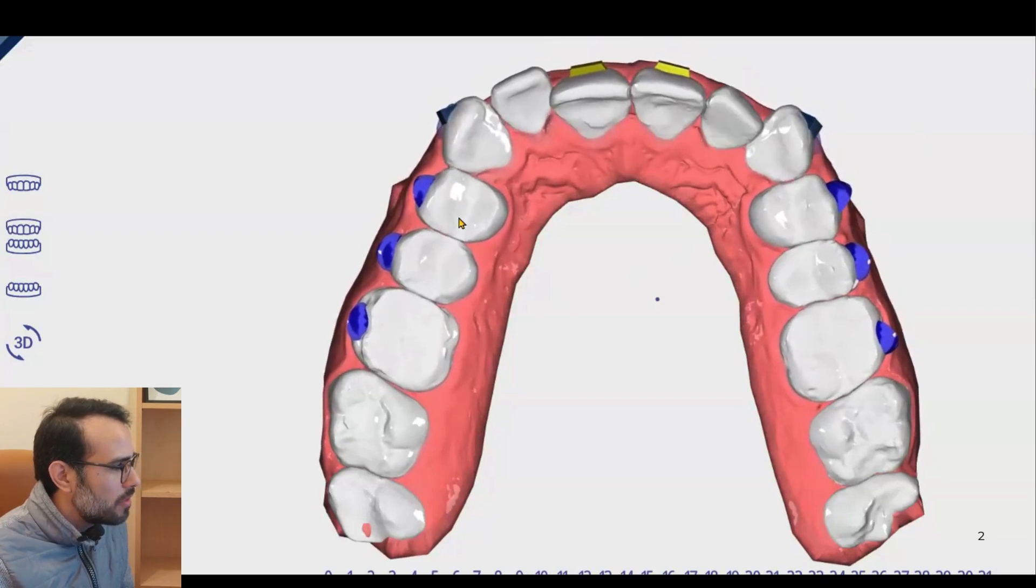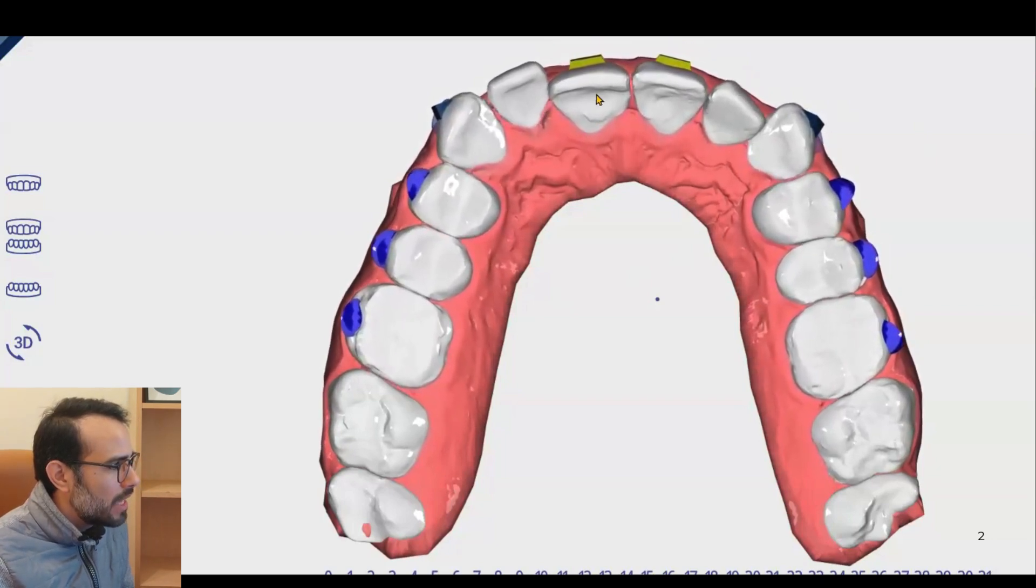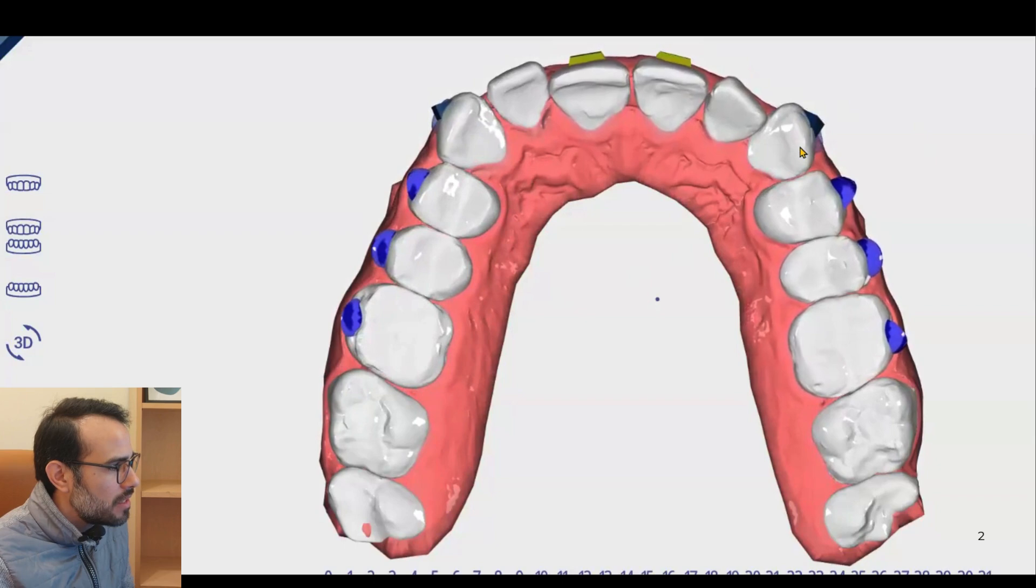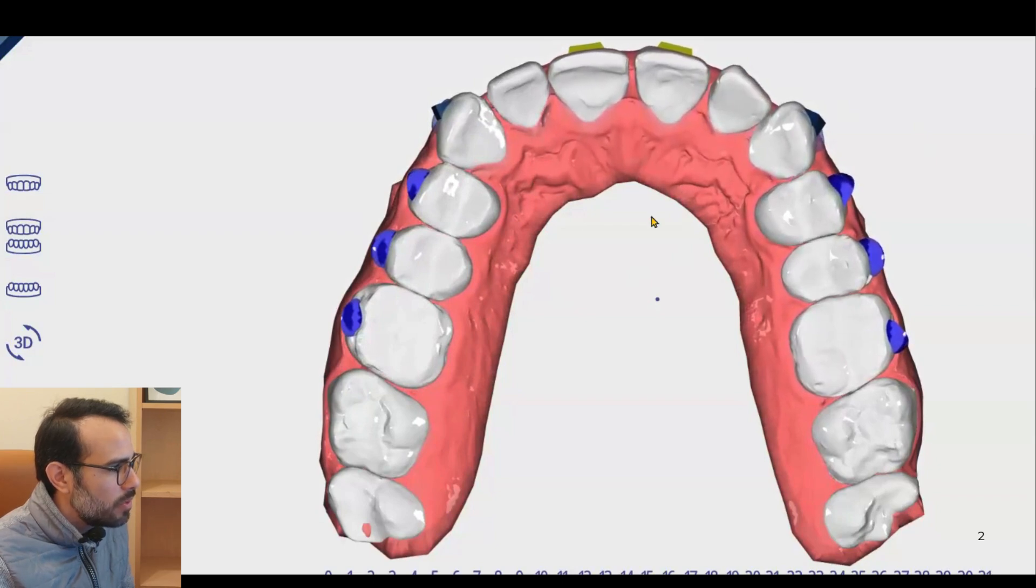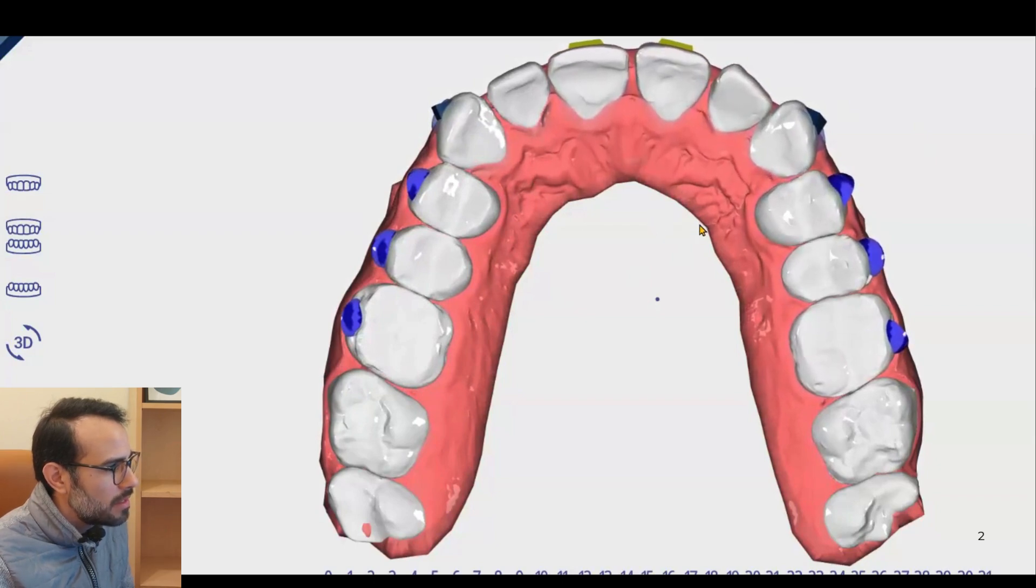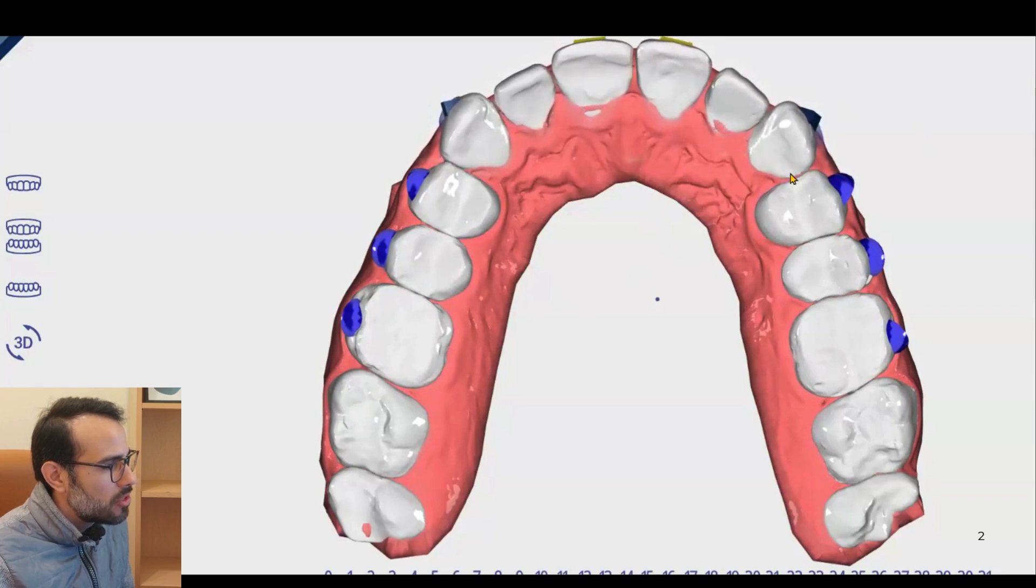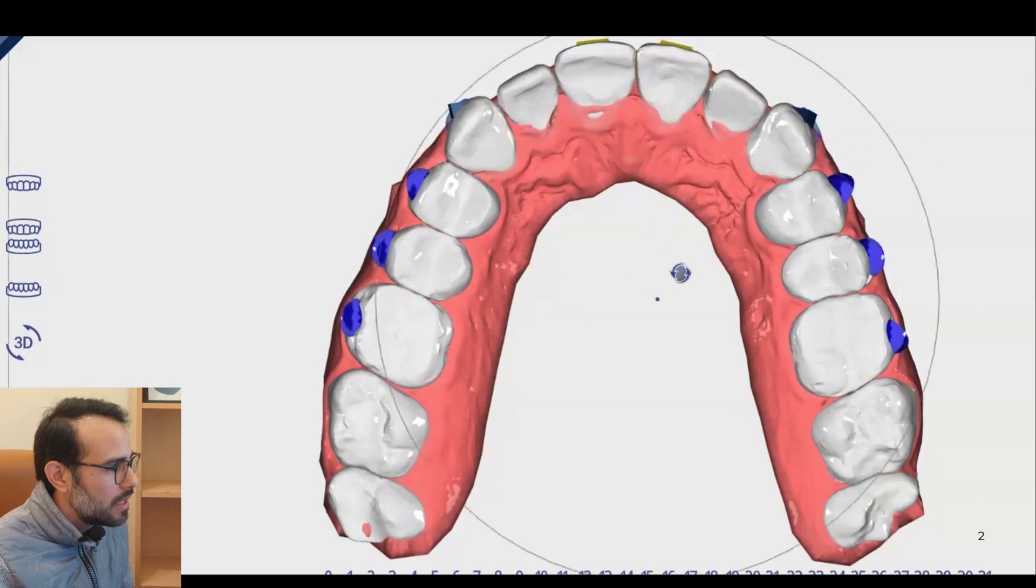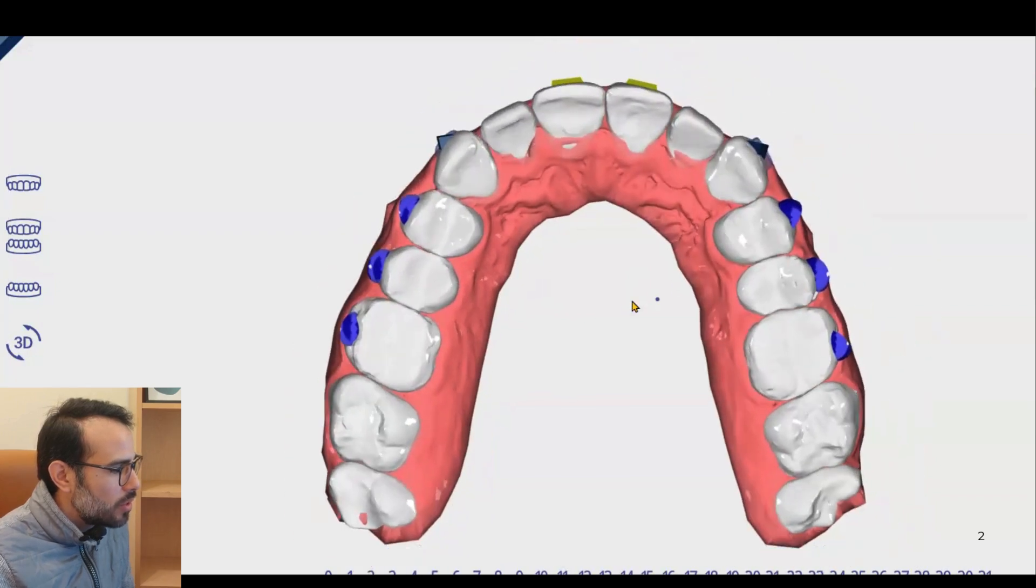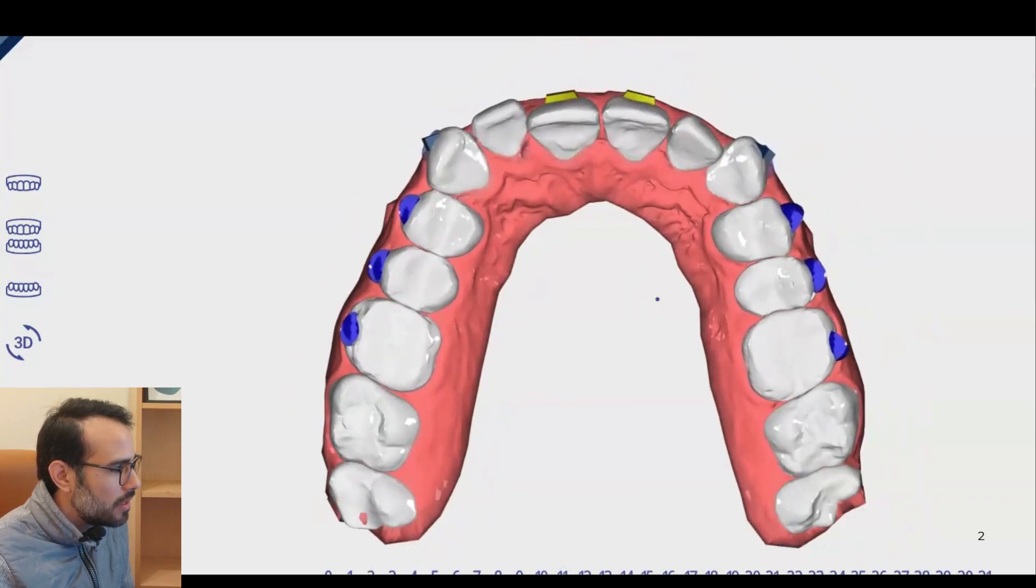So we made some expansion of the posterior teeth. We proclined initially the anterior teeth. We created space for the rotation, but for me, we made some mistakes in the treatment plan that we rotate the canines to the very end. We should have started with some distal-out movements and then mesial-in movements. This is one of the mistakes that I found.